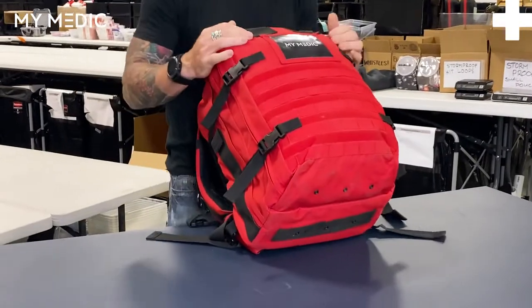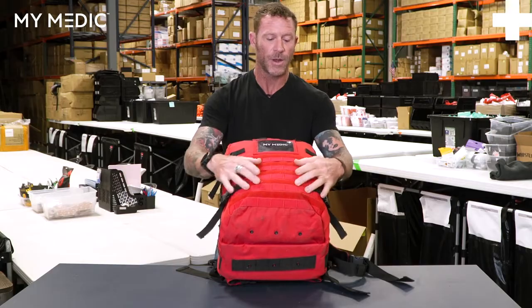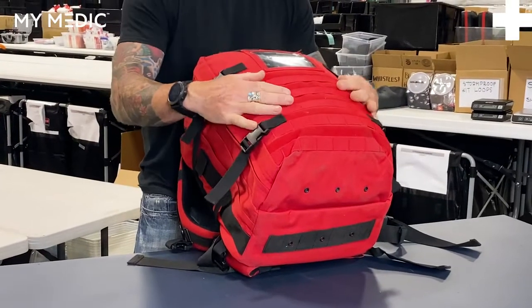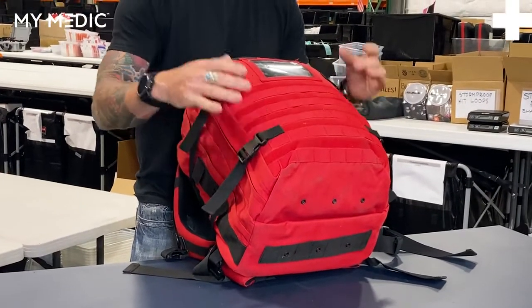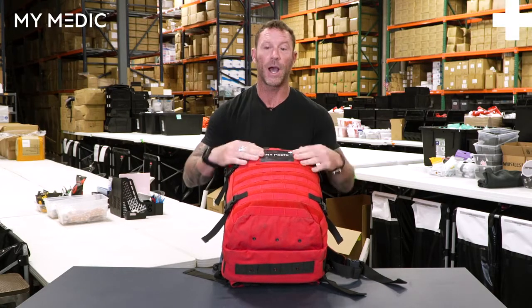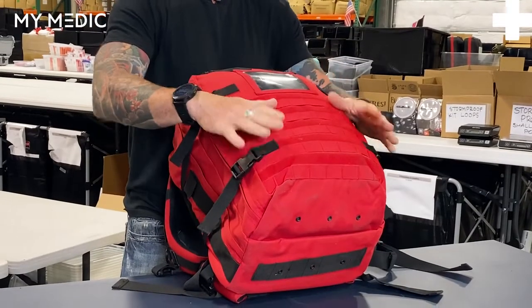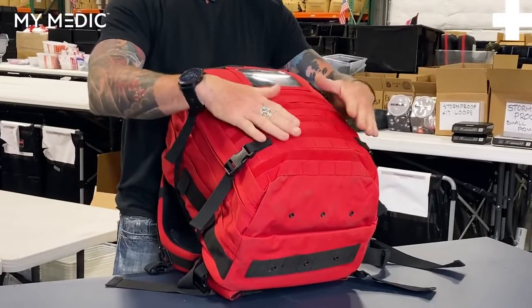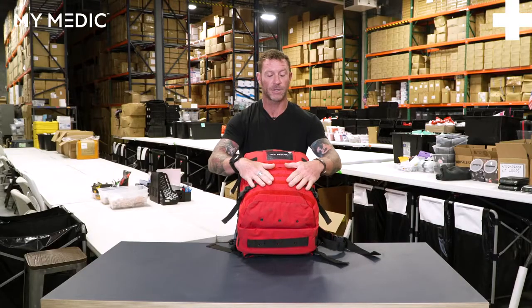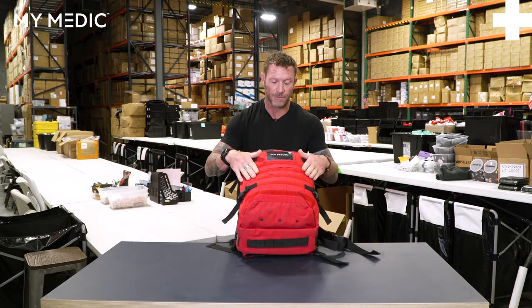Let's start with the outside. You do have some Velcro up front, so you can put your name tape or whatever kind of patch you want on here. You do have the clear window for additional information, whether it's contents, your company name, or whatever the case may be — there's a slot for that. You also have a MOLLE system up here, so I'd highly recommend some Billy bands to keep some tourniquets, tac lights, or whatever you want up front.